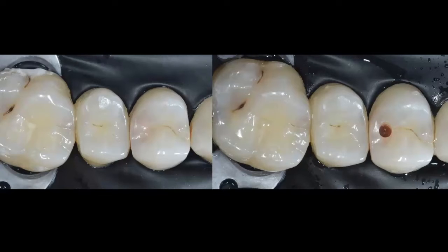So the first thing I like to do is initiate my caries access maybe a millimeter to a millimeter and a half away from the marginal ridge, or away from the neighboring tooth proximal wall, as you can see in the photo on the right. I have initiated my access using maybe a number 2 carbide burr or diamond burr, going through the enamel. In this particular case, there was so much decay underneath this almost intact occlusal surface that once I went through the enamel, the burr literally just dropped into that very soft underlying dentin.